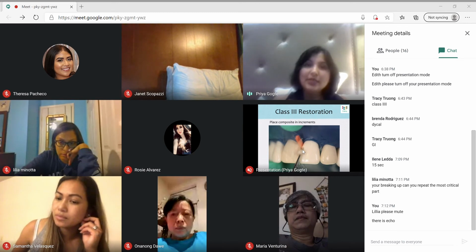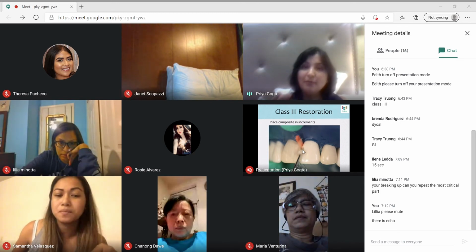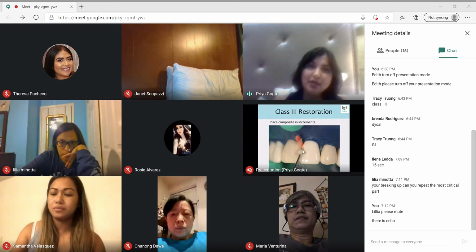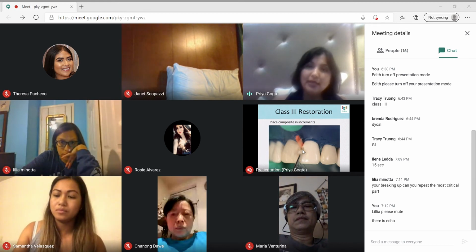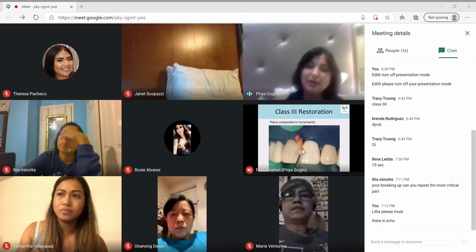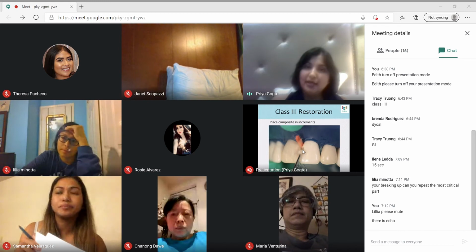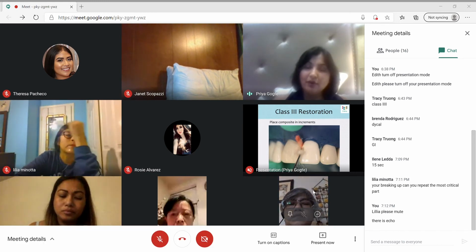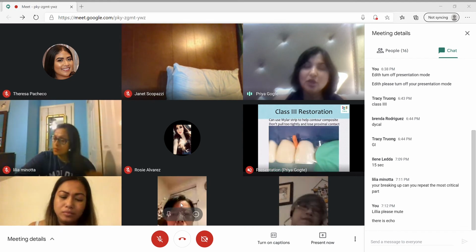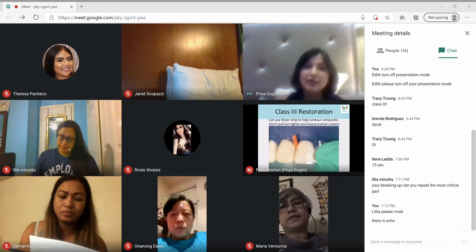Now, when I'm using a Voco, which is prime and bond mixed, my assistant has bond bottles separate, and she will pour the bond a little bit on a separate area, and then I will dip my micro brush into that, and I will use it. And it is very, very helpful. And it doesn't change the composition of composite.